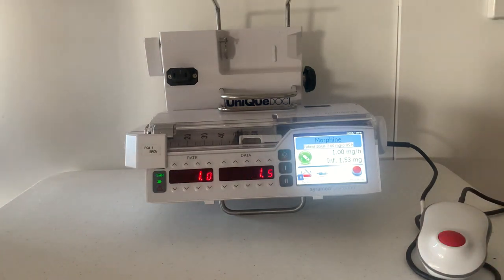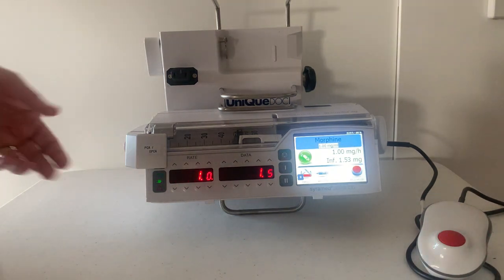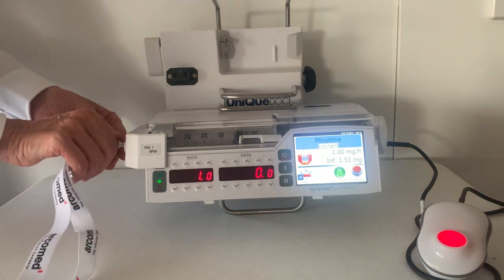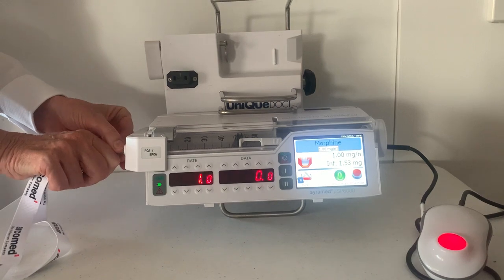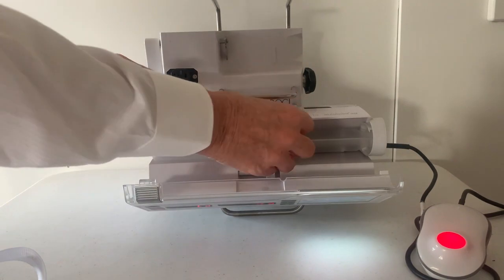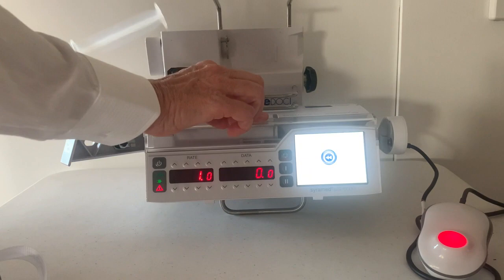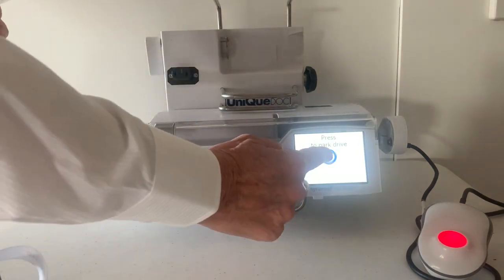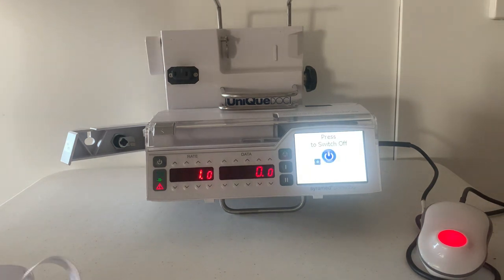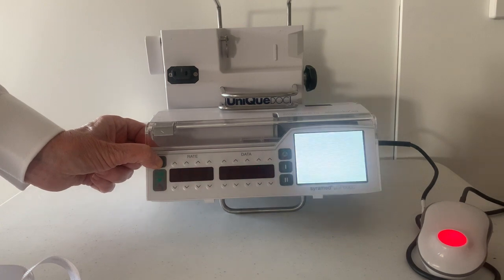Now I'm going to show you what to do when the infusion is discontinued. Stop the pump. Remove the syringe. Press to park the syringe driver. Press and hold the off key for two seconds.